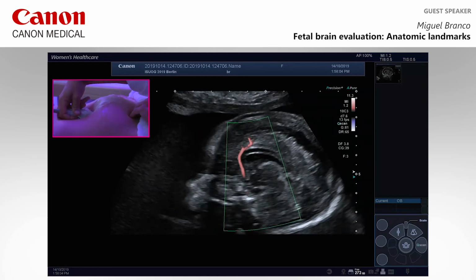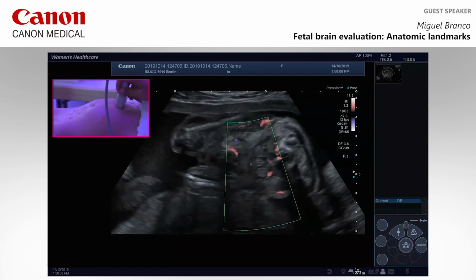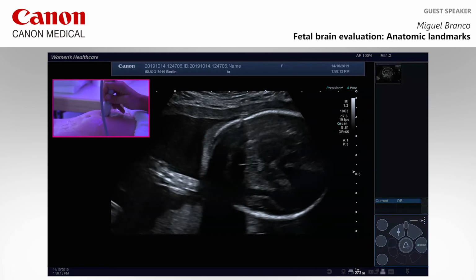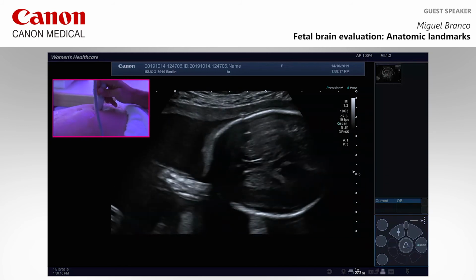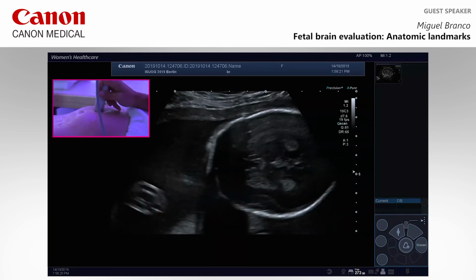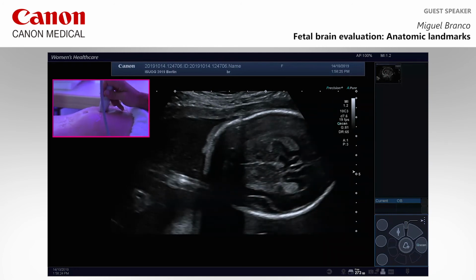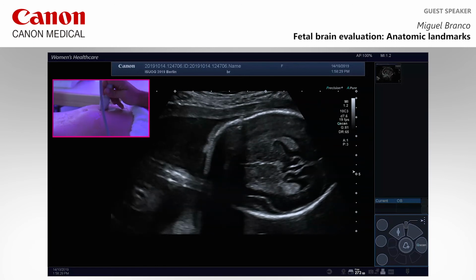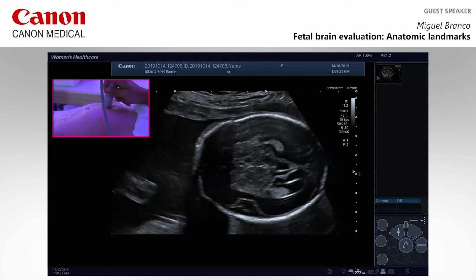How do you measure the CSP? Well, it depends on the papers. Sometimes it is on the middle, sometimes it is the wider portion of the CSP. The graphic from Xiaoyi is on the middle. The other one is the highest measurement.